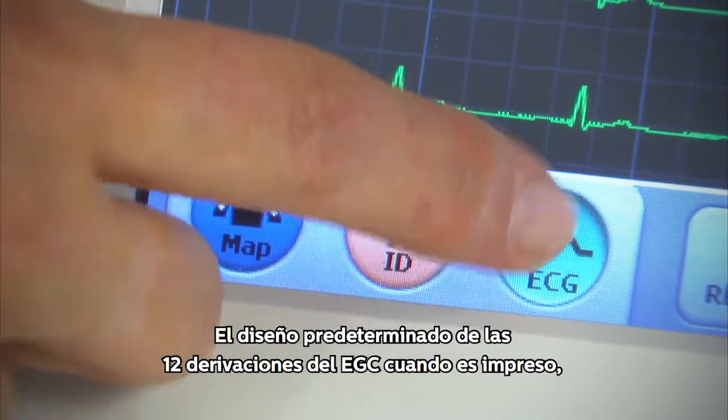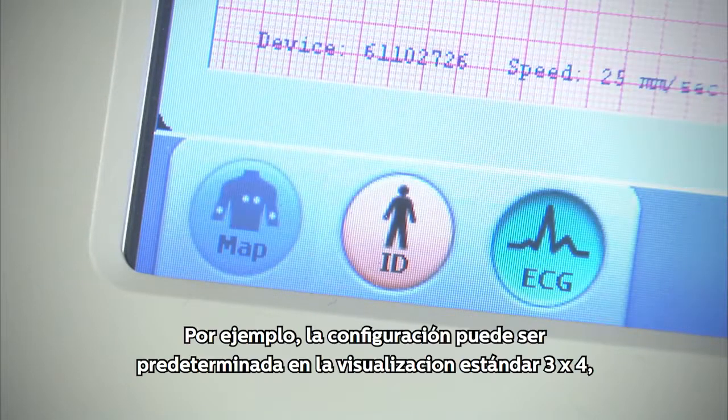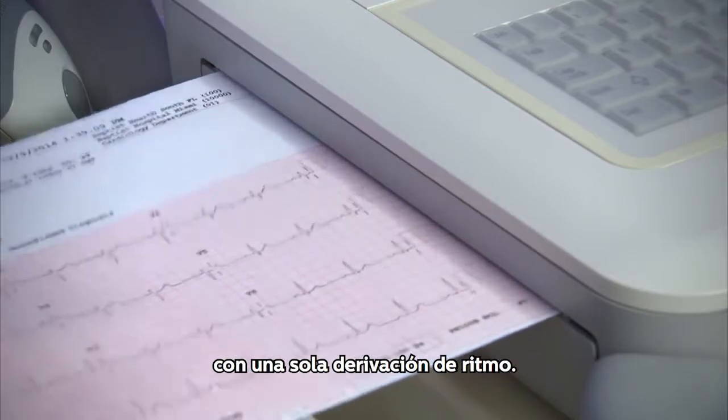The default layout of the 12-lead ECG when it is printed is configured in the cardiograph. For example, the configuration may default to a standard 3x4 with a single rhythm lead 2.